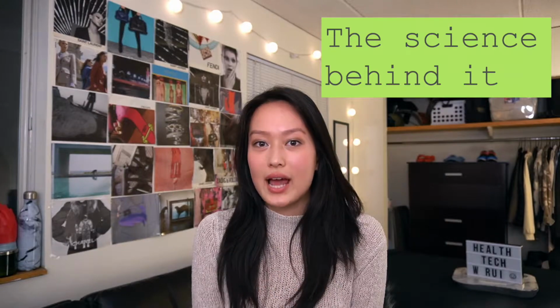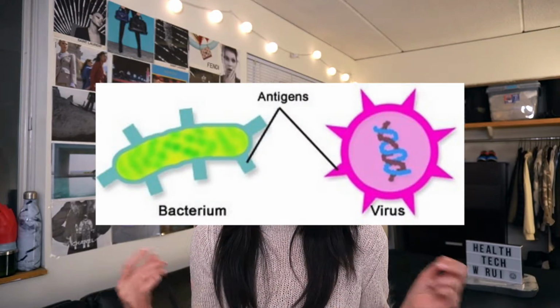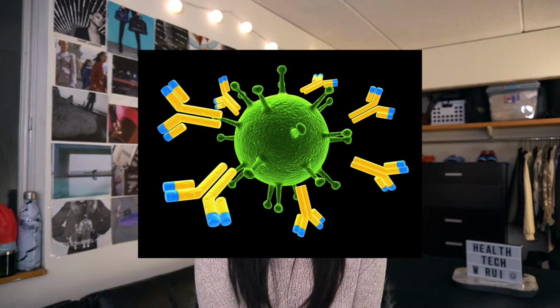This test will detect exposure to the novel coronavirus, and how it works is that in general, when your body is exposed to a new virus, the virus contains small molecules on it called antigens, which can create an immune response in your body. And the way that your body tries to protect you from this virus is by creating specific molecules called antibodies, which will then attach onto the antigens and basically counteract the effects of the virus.